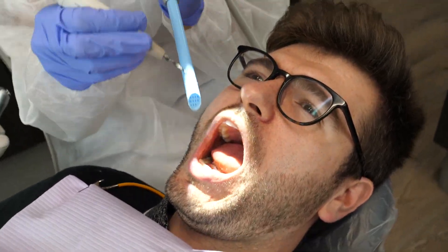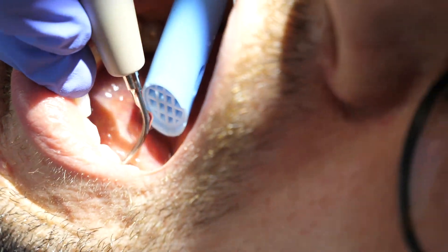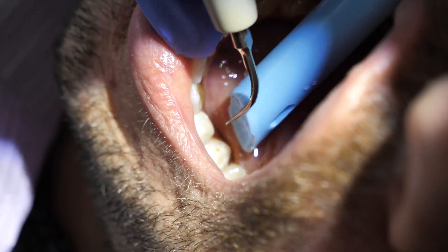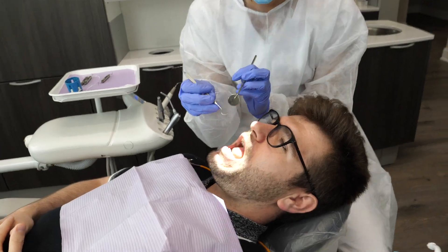Then I'll do all the motions again. Once you've found the piece, I will repeat everything: ultrasonic scaler, hand scaler, curette, and then ultrasonic again. Then again, I'll check with the floss, air, and the explorer.